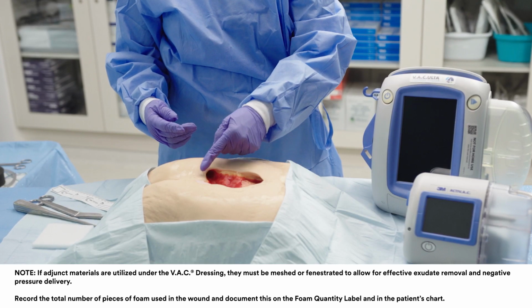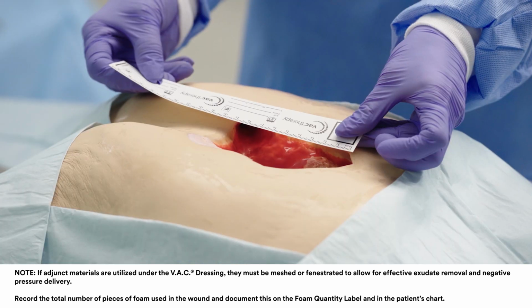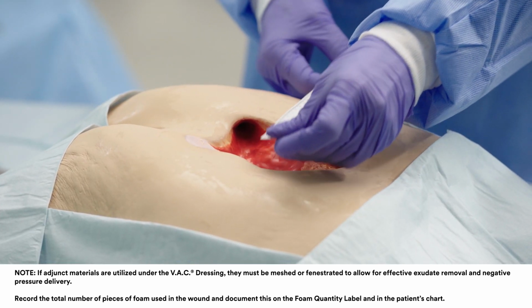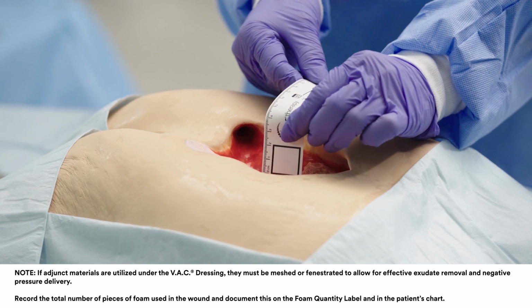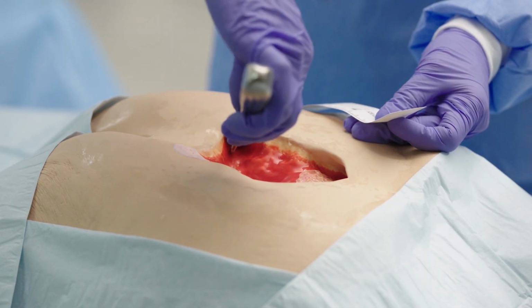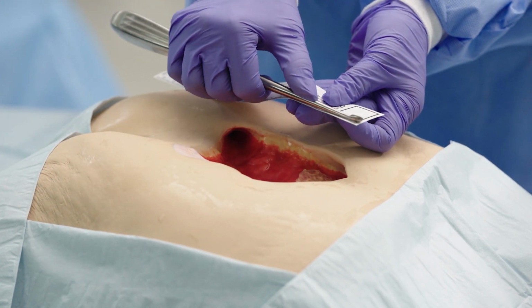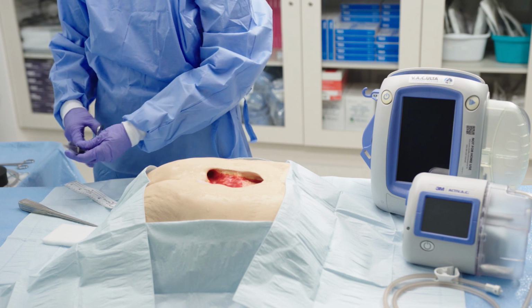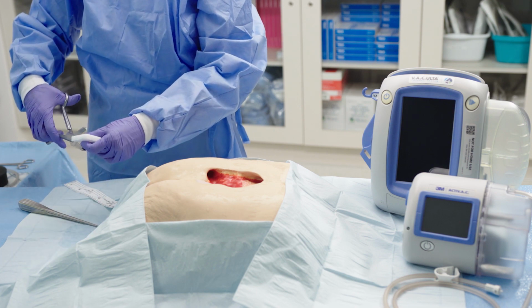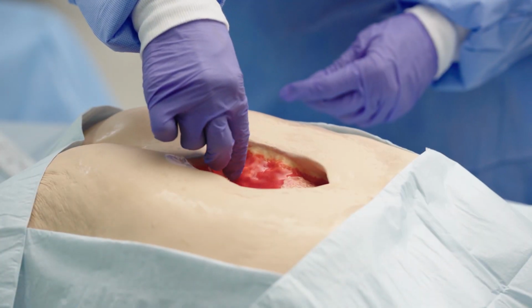Shown here is a wound in the sacral area requiring a standard VAC dressing using VAC drape. Assess the wound dimensions and pathology, including the presence of undermining or tunnels. Do not place foam dressing into blind or unexplored tunnels. Use VAC white foam dressing with explored tunnels.